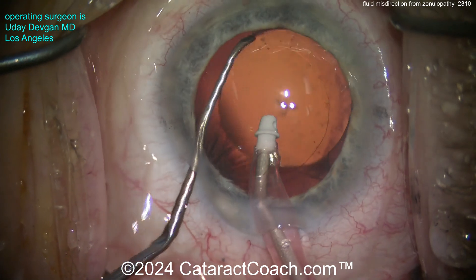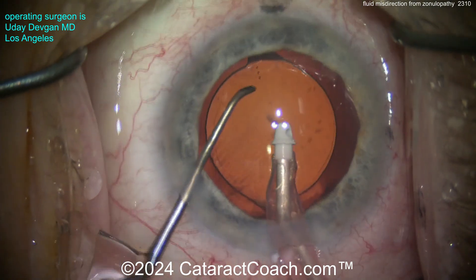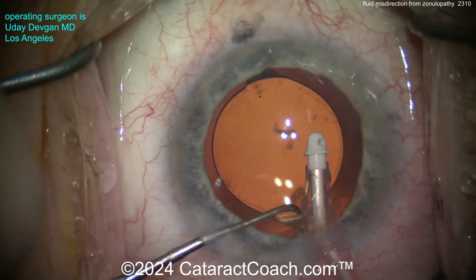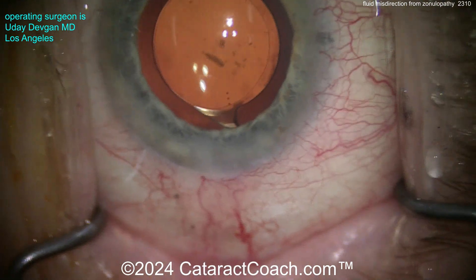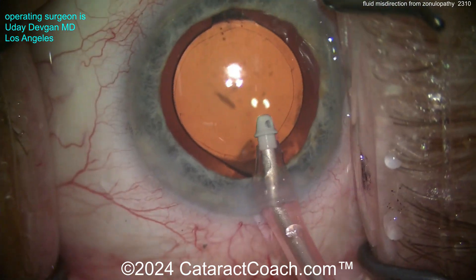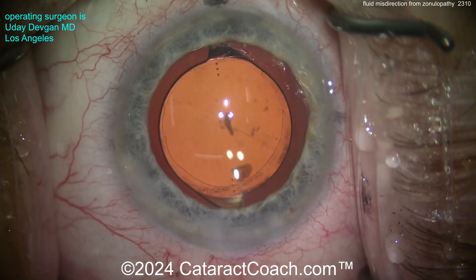They're going to dissolve in the cascade of inflammation — it's going to take a little bit of time but they should be fine. Notice those are not nuclear chips; those are little tiny fragments of epinuclear shell. Finishing the case up, removing the viscoelastic — everything looks good, got the toric lens in a good position with good overlap by the rhexis.